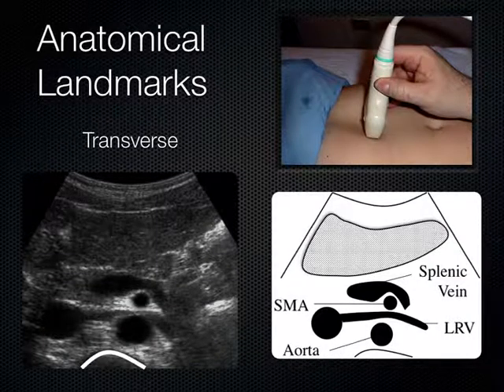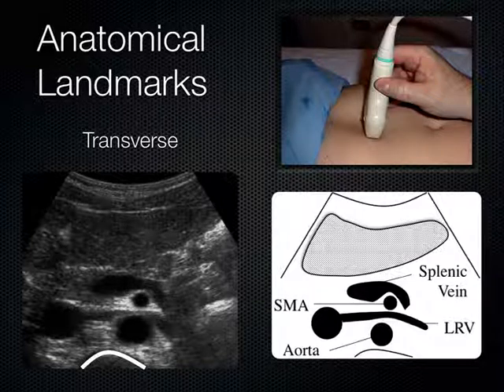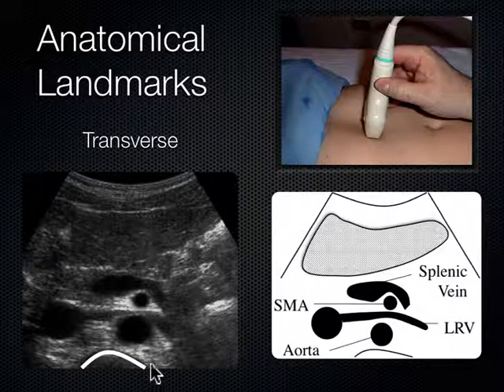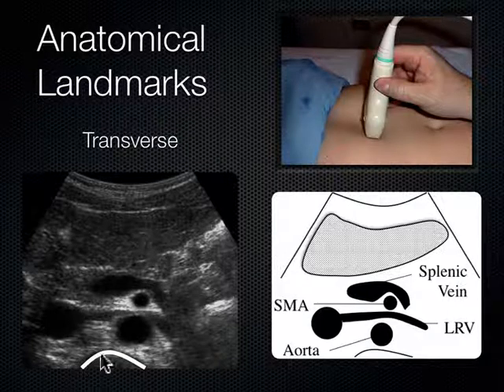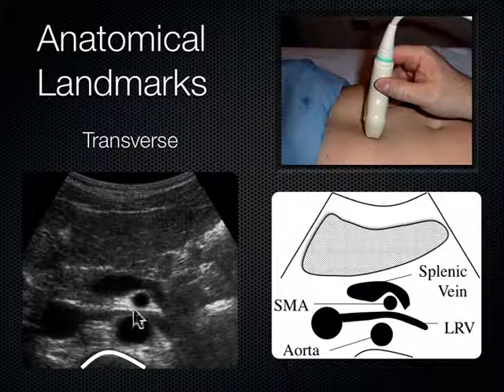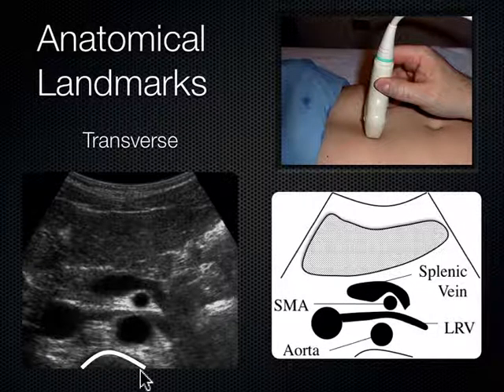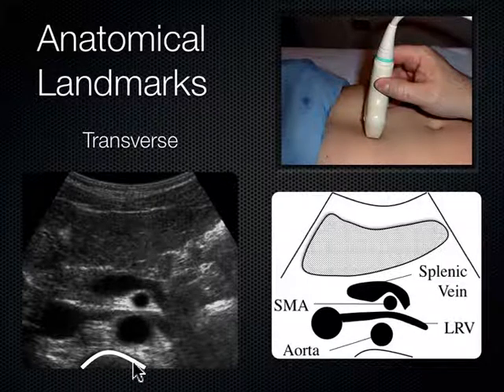Now we turn the probe into a transverse plane — we went from parasagittal right, aim the indicator to the patient's right, and now we're in a transverse plane getting a cross section of the body. The first thing I see is the spine shadow — where sound encounters the spine, can't go further, and bounces back up toward the probe. Moving anterior from the spine shadow, I'll name all these structures.